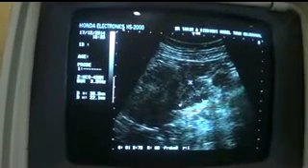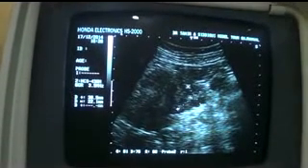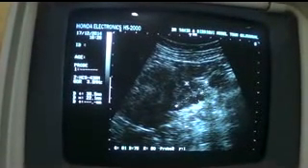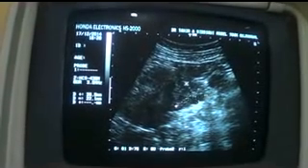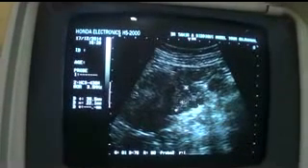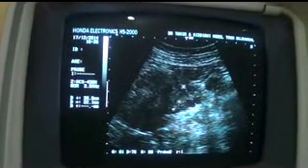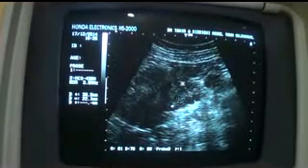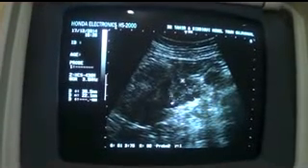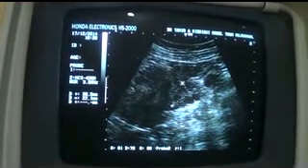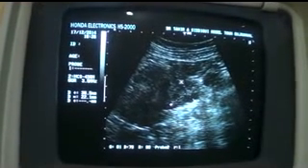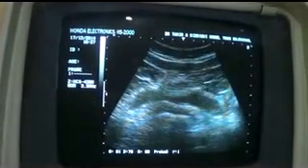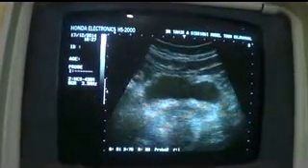This ovary measures 3.6 by 2.2 cm and this is the developing follicle — two follicles are seen developing in this ovary. So this is the basic technique of how to visualize the ovary.